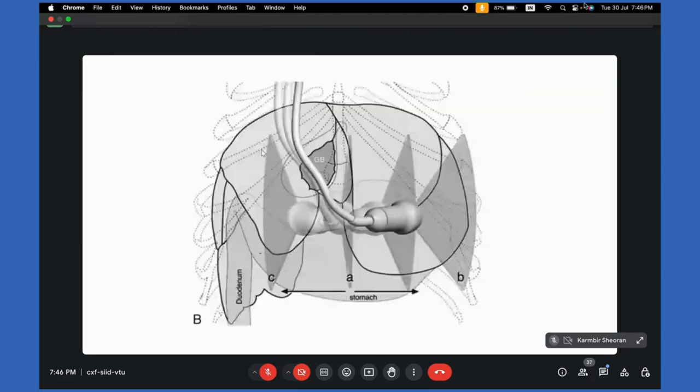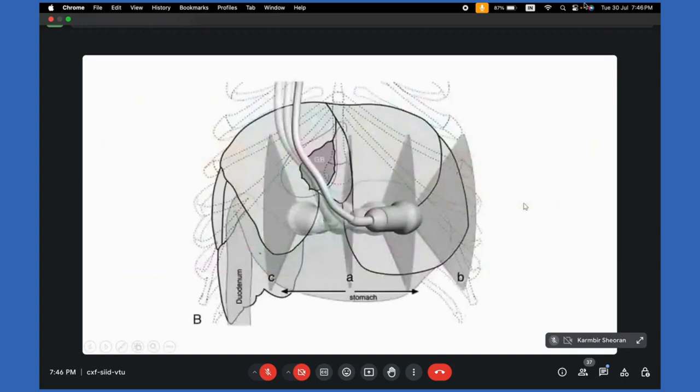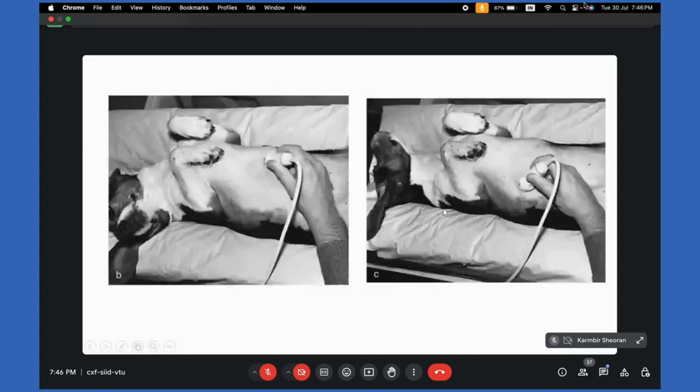So after performing the initial scanning, placing the transducer post xiphoid, we will do fanning. This is the fanning motion. We will go towards the left of the animal and then towards the right of the animal to scan the longitudinal view in multiple planes. We can displace the transducer towards the left to see the left hepatic lobe and then towards the right to see the right hepatic lobes.